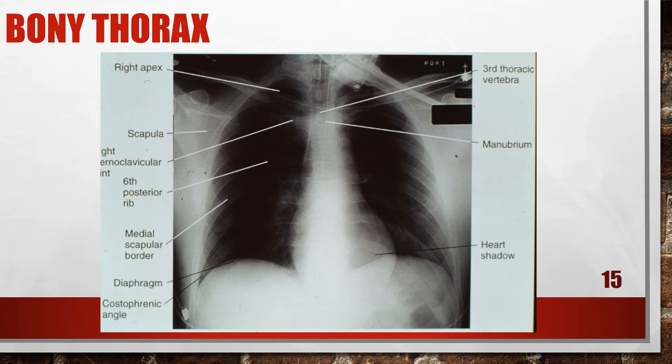This is an accurately positioned AP chest x-ray — this is a patient that is in the ICU. When I'm taking pictures in the ICU, I want to make sure I ask the nurse if I can move the leads out of the way, especially if I'm shooting a chest x-ray for tube placement or line placement, so I don't have any extra wires in the way.